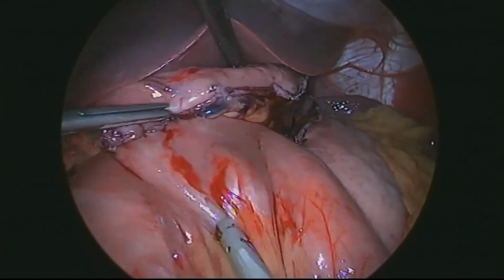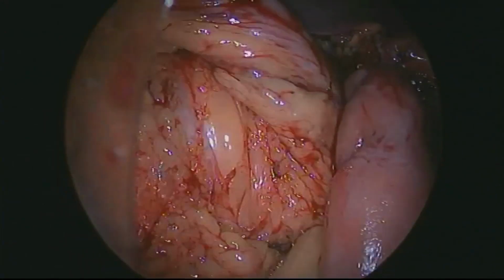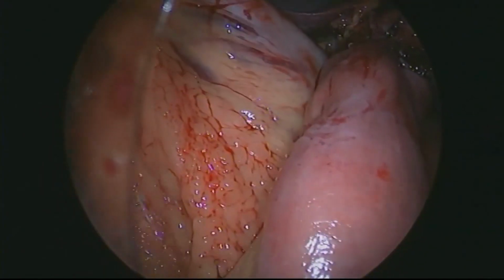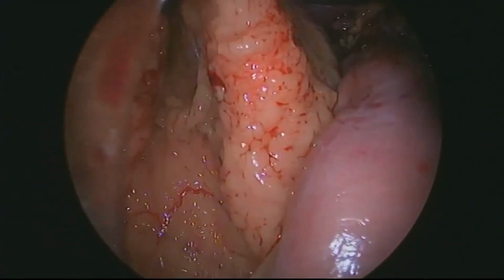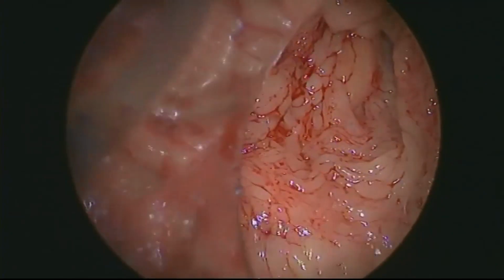This patient just underwent, or was in the process of undergoing, the OAGB, and at the end we must close Peterson's defect. This video, which is unedited, will show you our technique to do that.